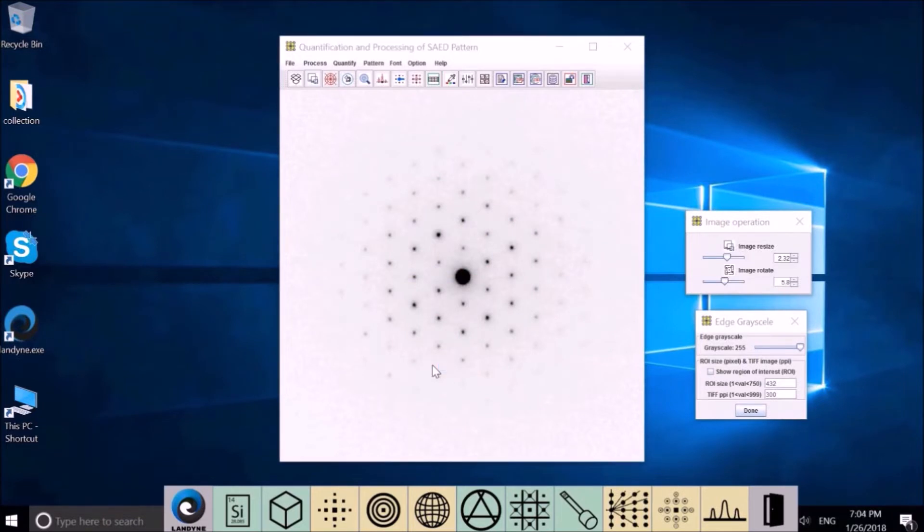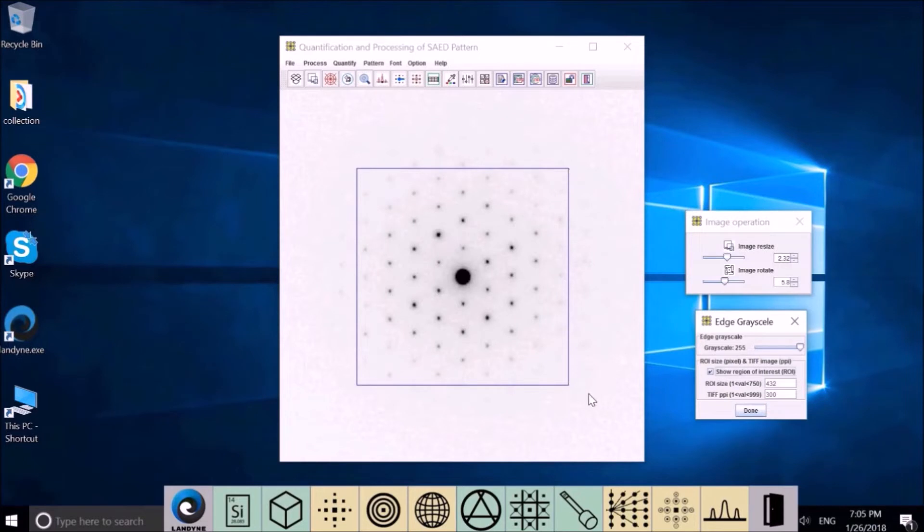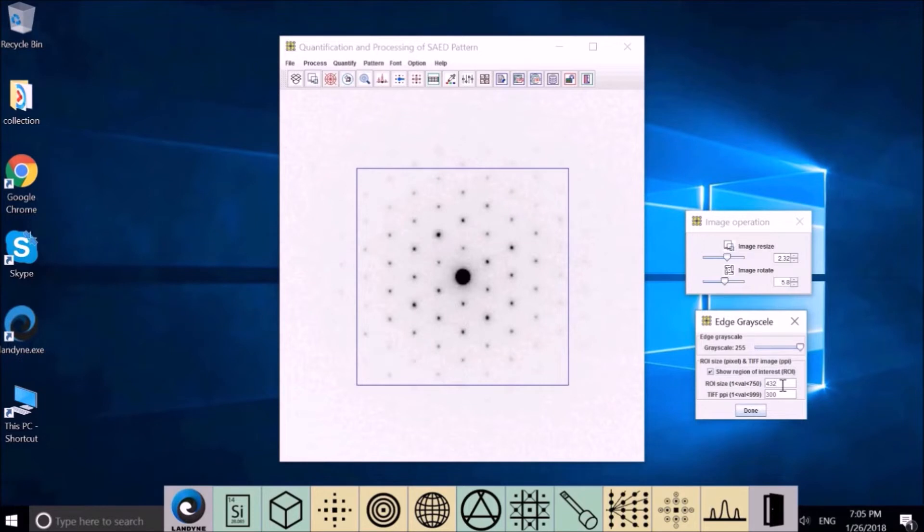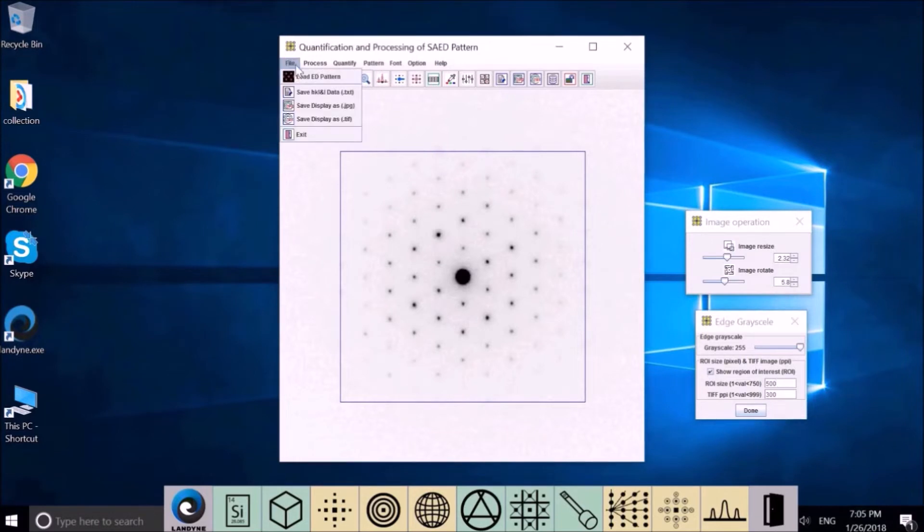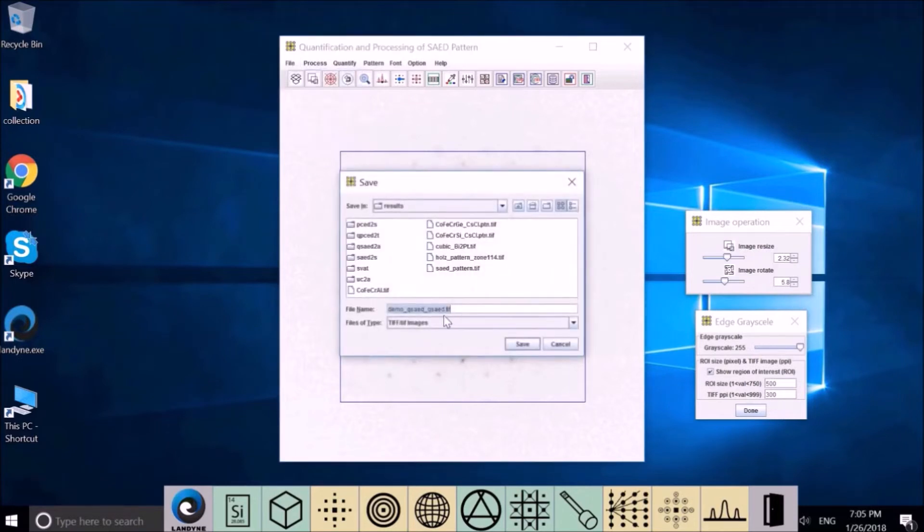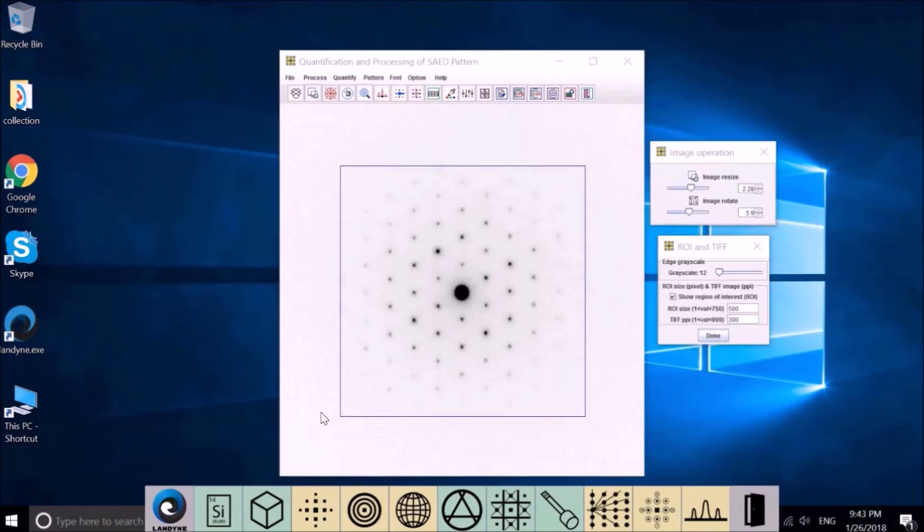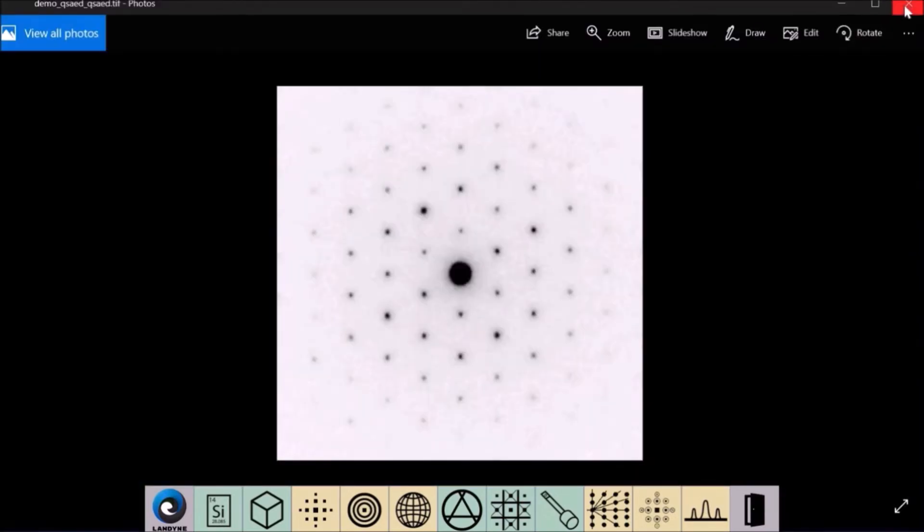Save the image. Click here. It shows this square inside will be saved. Let's change the size to 500. Immediately the size changes. Now go to File, save TIF image. You can change the name here and go to save. The saved image is in this file.